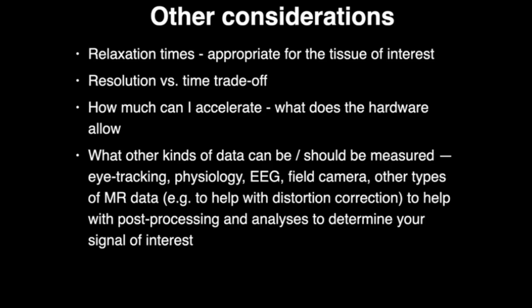You can even collect other types of MR data that help with your post-processing and your downstream pipeline analyses. So if you have concerns about breathing or distortion, it's worth having conversations with us and the AFNI team, and seeing how you set up and optimize your acquisitions to have the information on hand that you need.